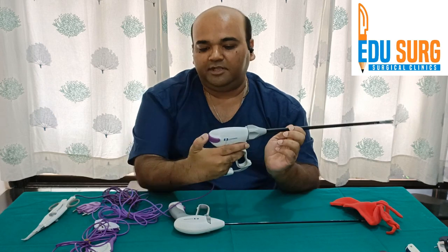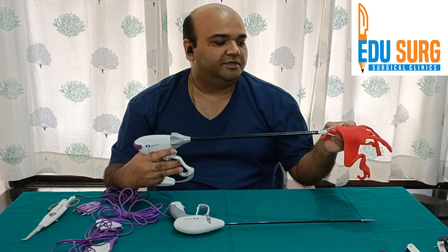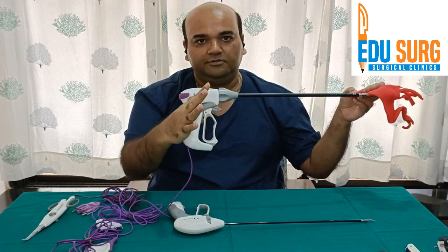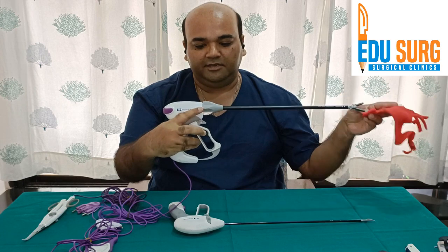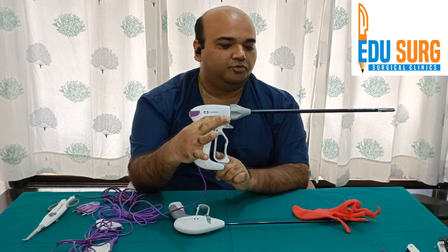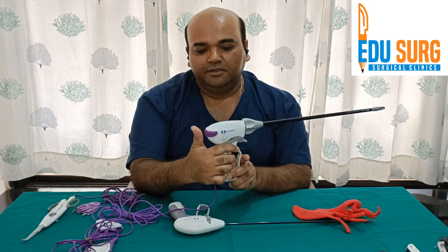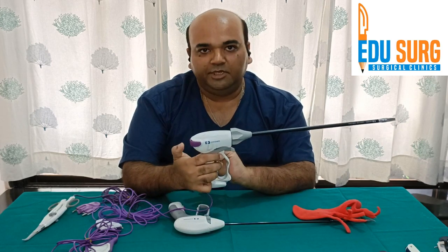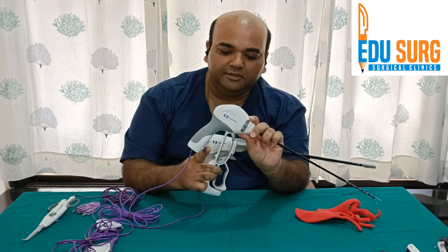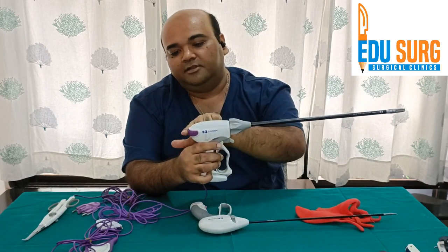The difference in LigaSure Atlas is that the bipolar activation is at the back. Once you have held the tissue, it gets locked — there is a locking mechanism here that is not present in Maryland. Once you have locked this, you can activate the bipolar separately. So when using LigaSure Atlas, your thumb needs to be free because the bipolar activation is separate. In Maryland there is no locking; here you have locking and the knob is separate.